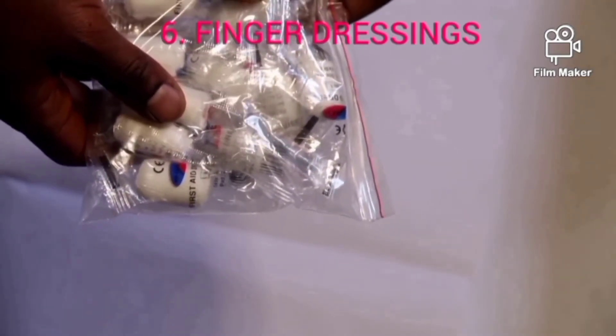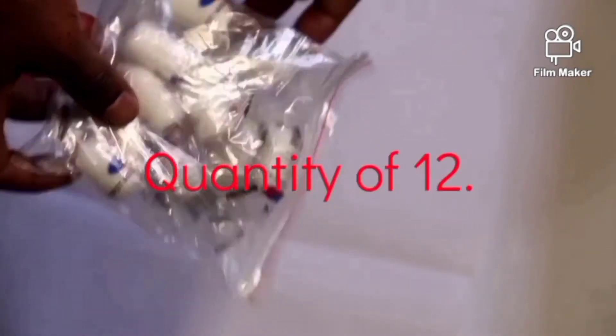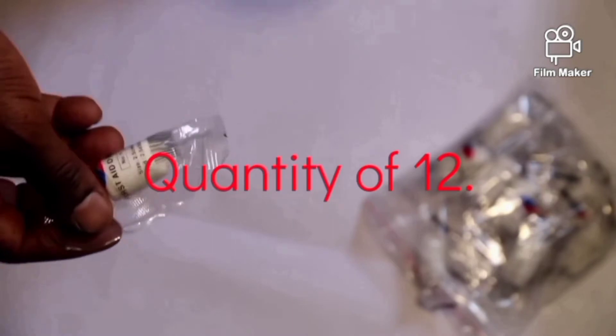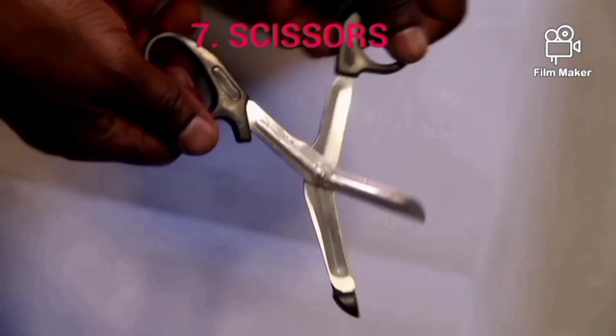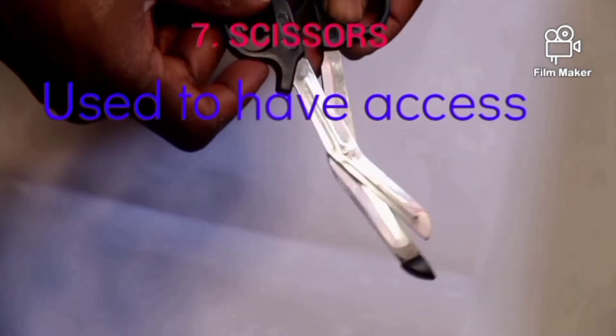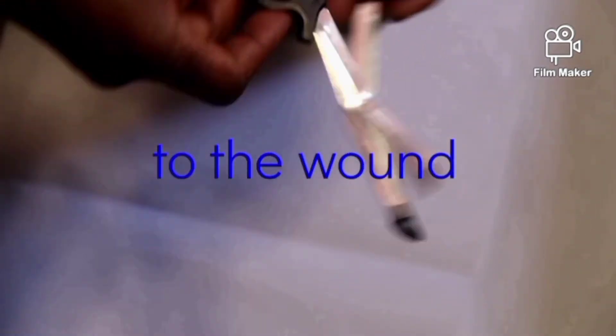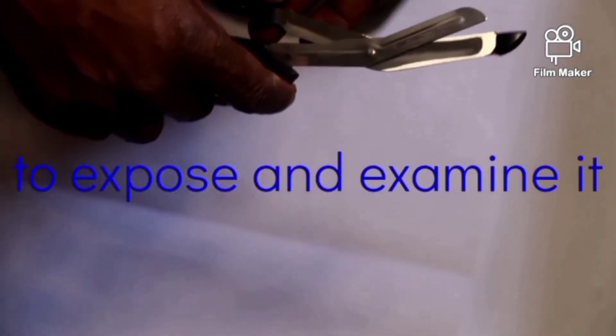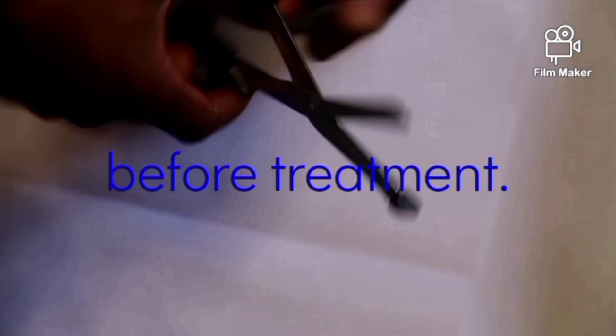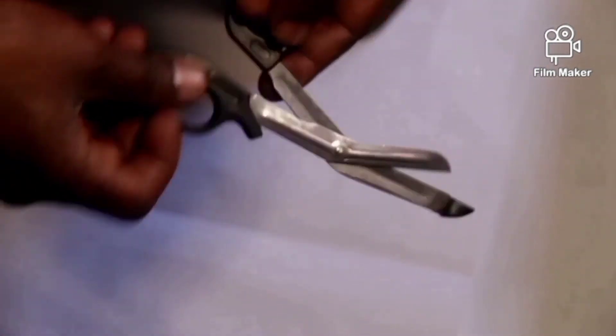Finger dressings come in a quantity of 12. These are small enough to be applied on a finger. There is also a pair of scissors. This is used to have access to the wound by cutting a piece of cloth from the injured person to expose and examine it before treatment — we cut the cloth so that we can expose the wound, examine it, and do the treatment thereafter.